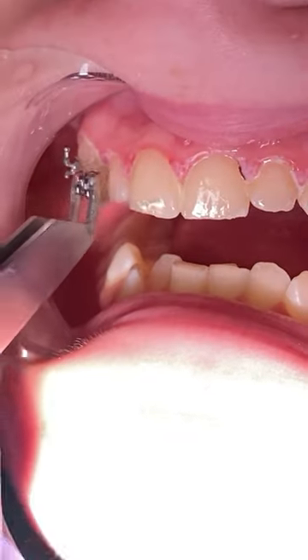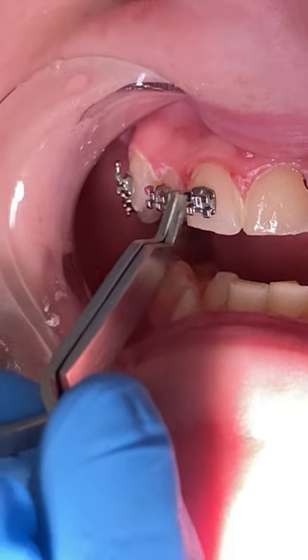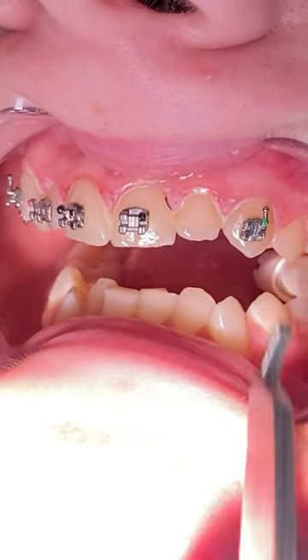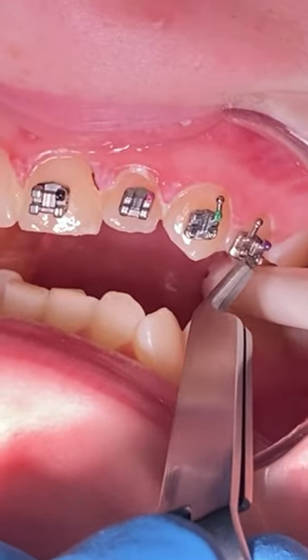In some cases, you can start braces just on top. In this case, the patient has a very deep bite, so we're going to start with braces on top only — if we put braces on the bottom, she's going to bite down on them and cause the brackets to break.